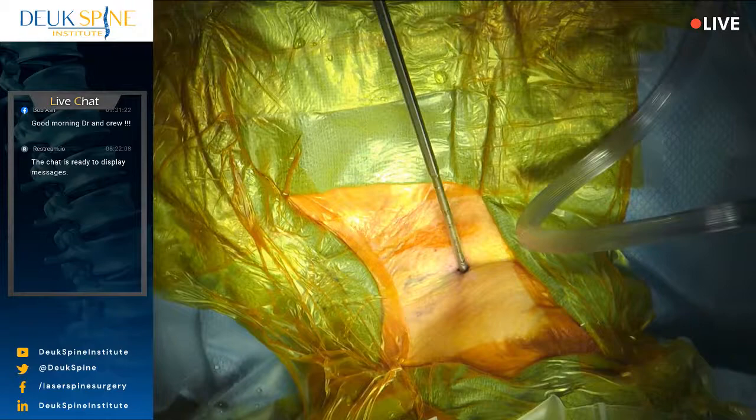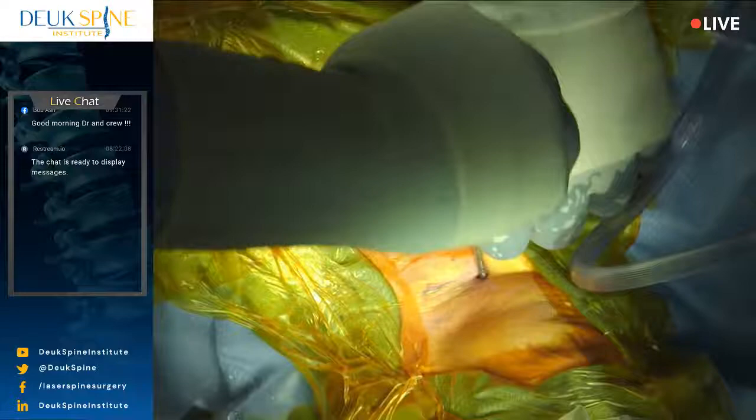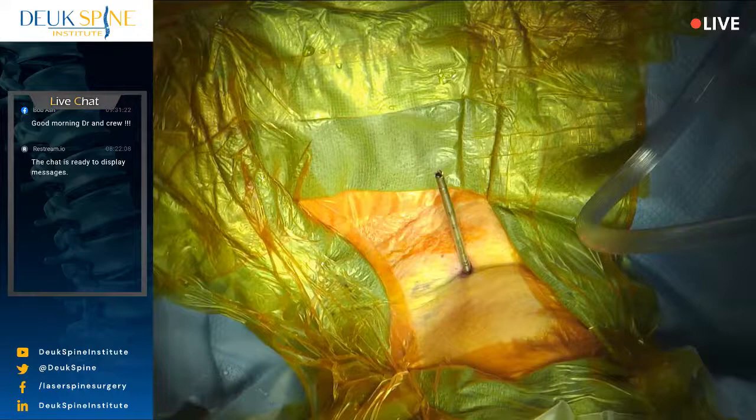We're gonna start removing the herniation and we're gonna advance the tube a little bit more as we go along. Let's see, shot. So once again, we have to use the x-ray machine to guide ourselves here because we're using metal instruments so we can see it on the x-ray. Yep, keep going. So the dilator has been removed.